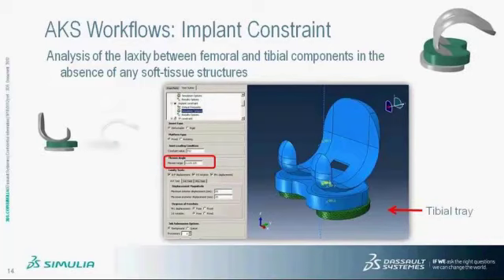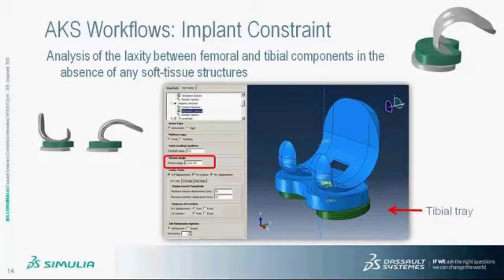Here, I'd like to point out that although the name is the same for input, the flexion angle in this case not only indicates the beginning and end angle and the output angle, it also indicates where the laxity test will be performed. In this case, since I entered a 120 degree interval, the laxity test will be done at 0 degree flexion and 120 degree flexion. So if a smaller increment is provided by the user, that means a lot more laxity tests will be performed at each interval.